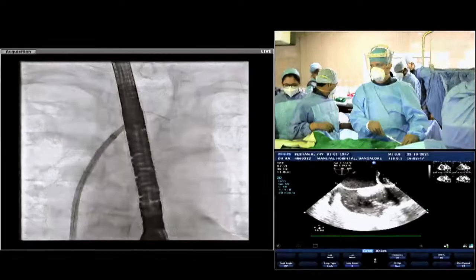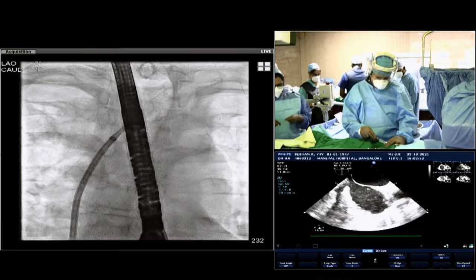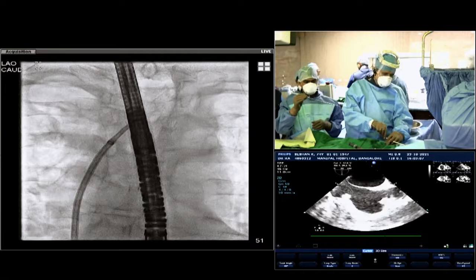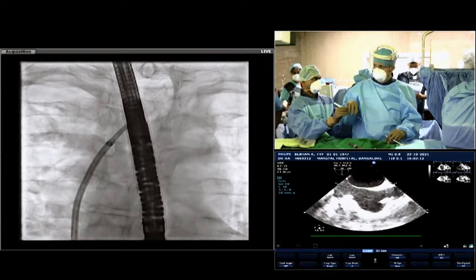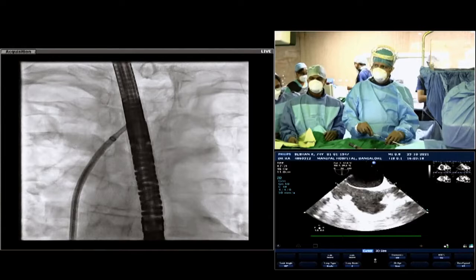This was a case shot as a video at a conference. A 74-year-old male with recurrent CVA, ischemic embolic stroke to the pons, left hemiparesis, CHADS2 score of 4, multiple episodes of severe iron deficiency anemia requiring blood transfusion, IHD, and EF of 48%. For LAA closure there are two or three critical steps: the septal puncture, sizing, and delivery of the device. All of us need to learn TEE-guided septal puncture — that is what you need for almost all interventions.